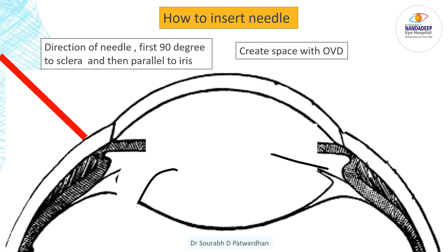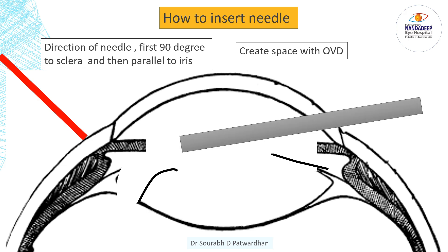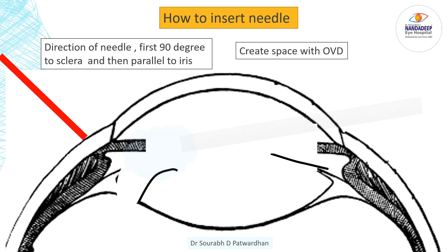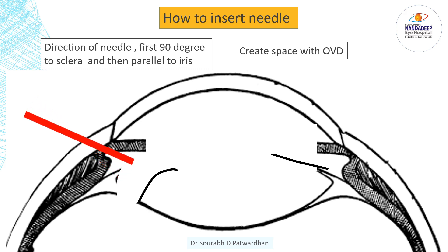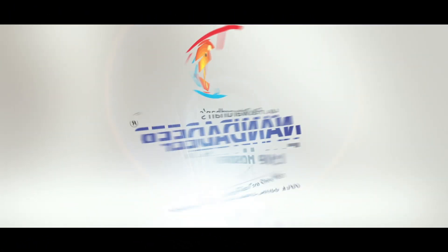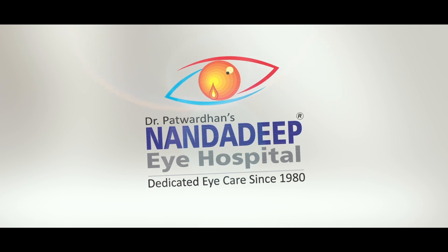Another important tip is how to insert a needle while fixing the bag to the sclera. The important thing is to create space between the iris and the bag by using proper OVD, and then you insert the needle first at 90 degrees until it penetrates the sclera and then turn it so that it becomes parallel to the iris. This avoids trauma to the iris root and it stays behind the iris.